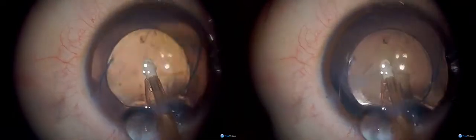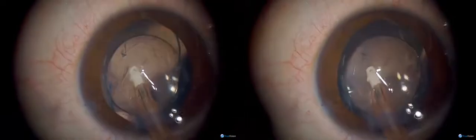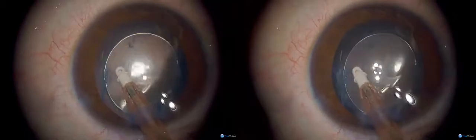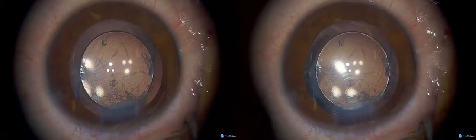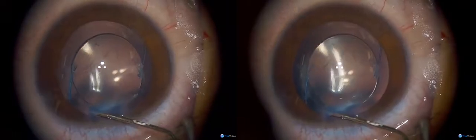Why would you not consider putting a multifocal IOL in a child of this age? That's a good question — I would. In the UK that's exactly what I would do. There's not a lot of data about how well they work, but it is something to consider. You also have to consider the various problems you can get with multifocals — they're not perfect lenses by any means. We haven't got them here, so it's simply for that reason.